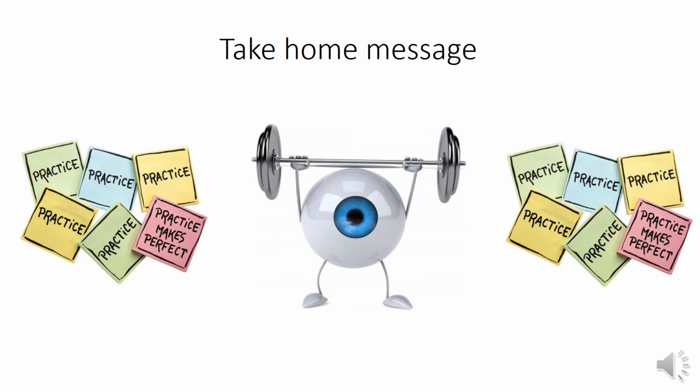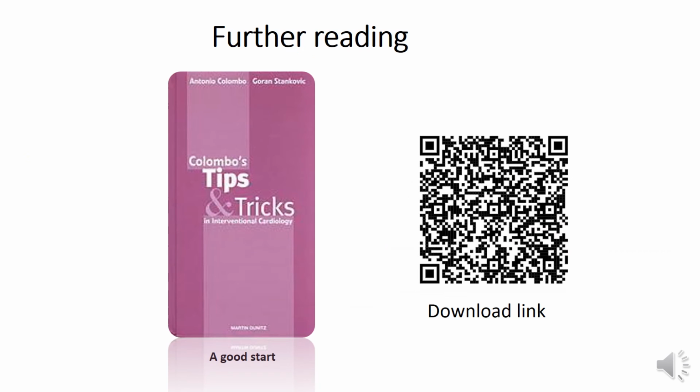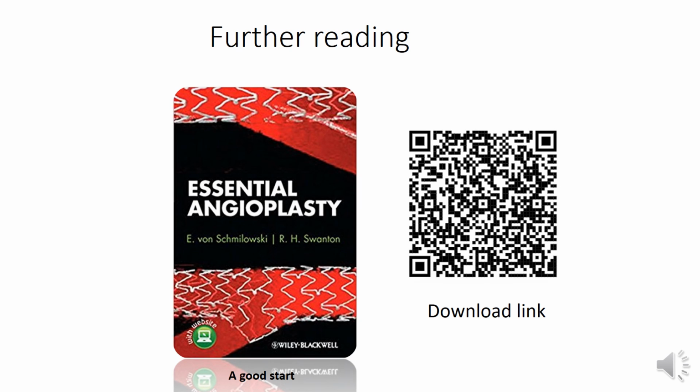So finally, my take-home message is that learning coronary angiography depends on practice. As we said before, it is an eye exercise, so the more you see, the more rapidly you get familiar with the views. And you can find on this link a valuable book by Dr. Colombo called Tips and Tricks if you're interested in more of the basics of interventional cardiology.